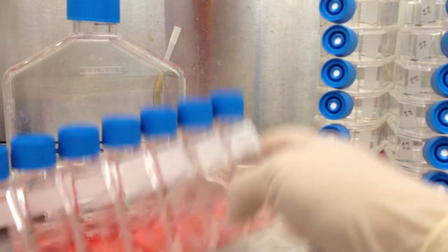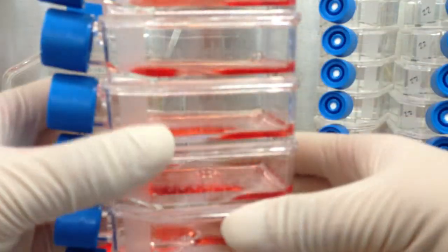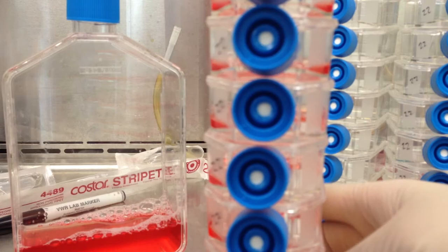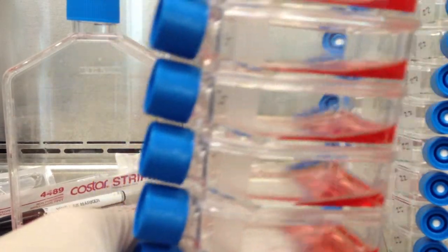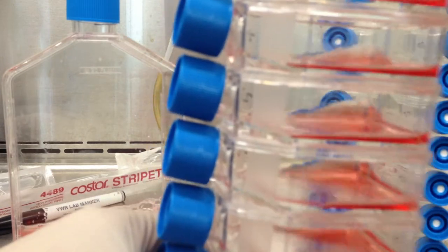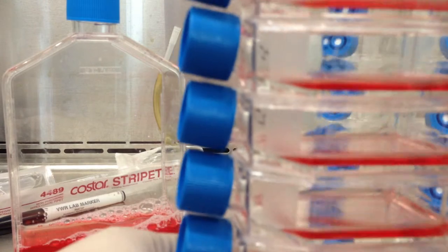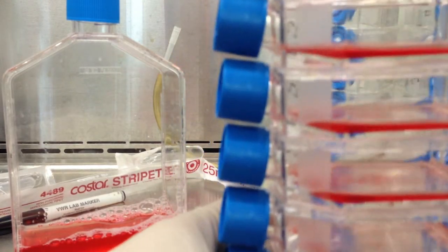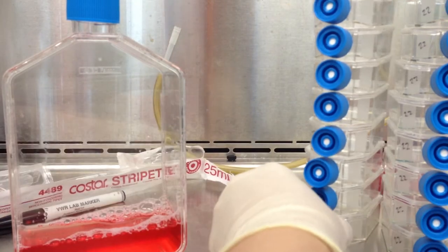Together. Make sure not to get any of the media into the tip or the cap, especially if you have filter caps, because that will ruin the filter. And then kind of circle it around a bit, and this is to make sure that the media covers the entire bottom of the flask. Get a nice uniform monolayer later, and just put it off to the side. It'll be fine.